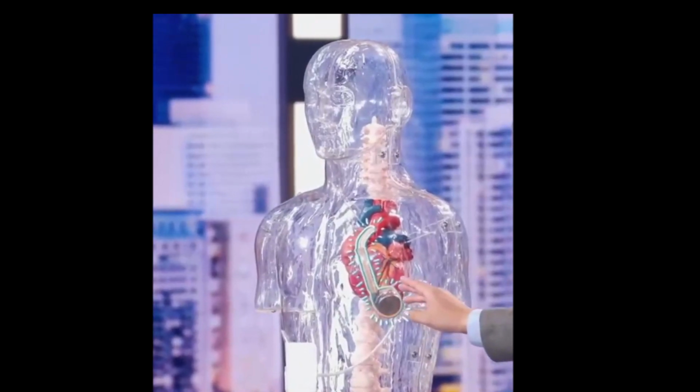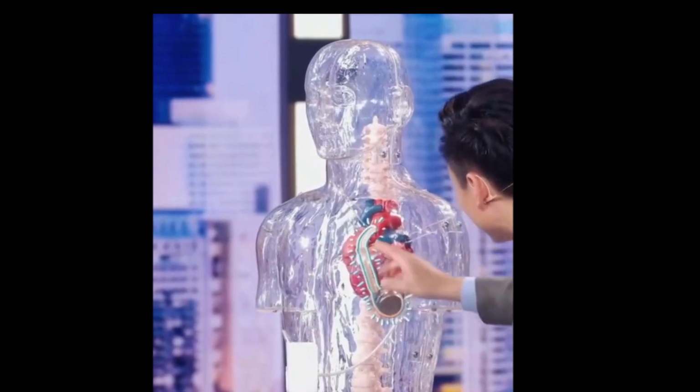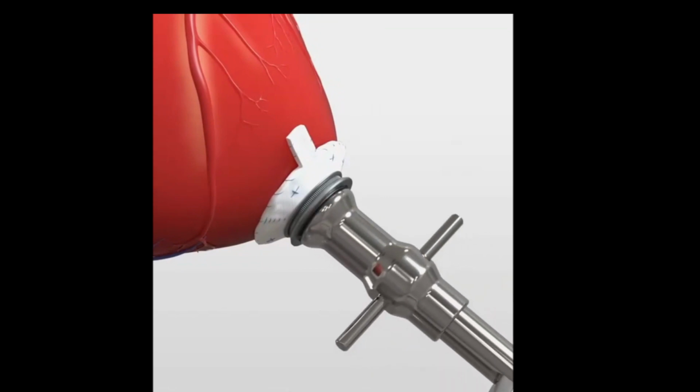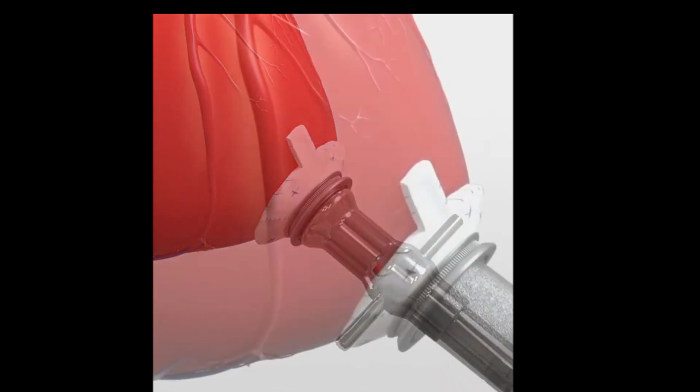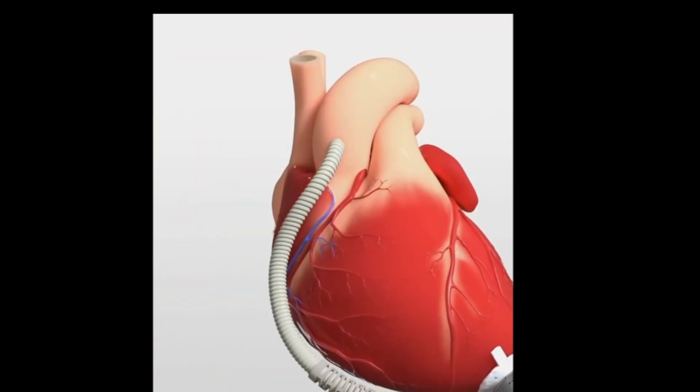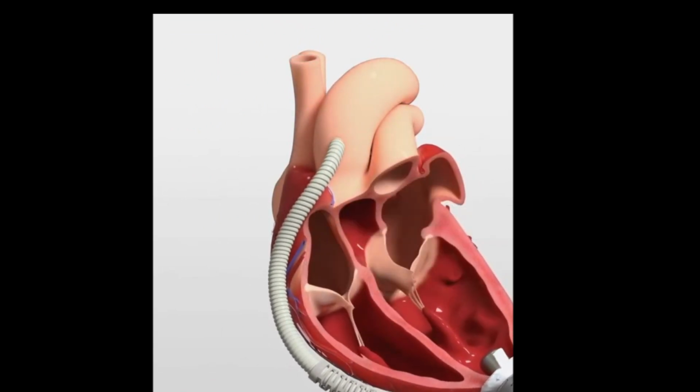The scientific name of artificial heart is ventricular assist device, abbreviated as VAD. Its essence is a pump that can help promote blood circulation in the body, provide necessary blood supply to body tissues, and maintain necessary blood pressure. It mainly consists of 4 parts: blood pump, power device, monitoring system, and power supply. There are various types of artificial hearts, including left ventricular assist devices, LVAD, and right ventricular assist devices, RVAD, but the most mature clinical application is still left ventricular assist devices, LVAD.